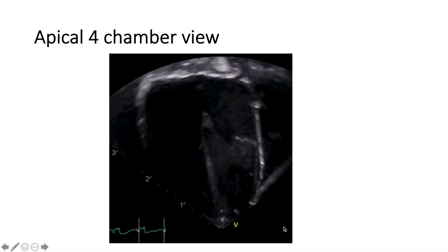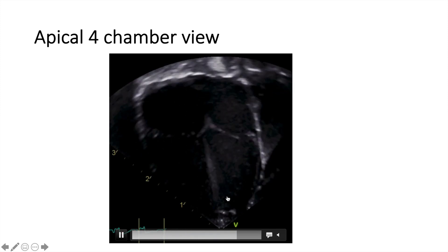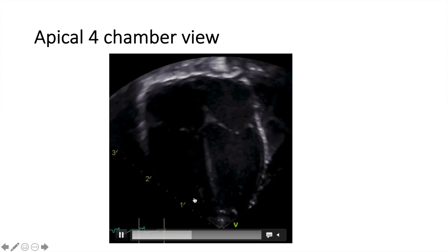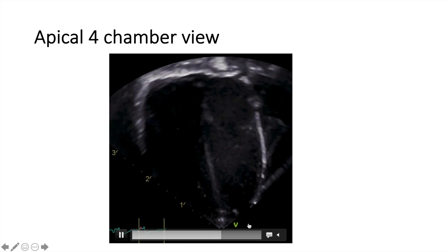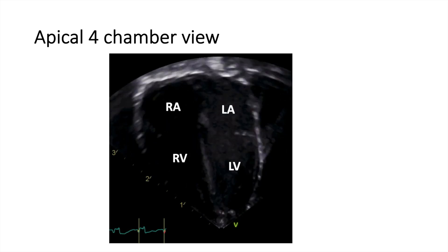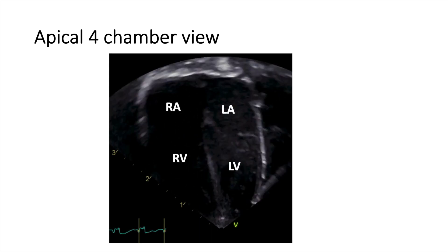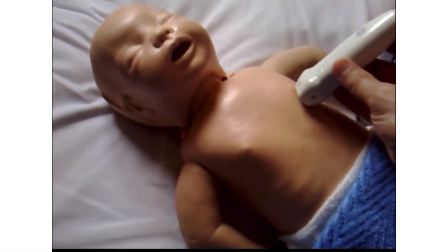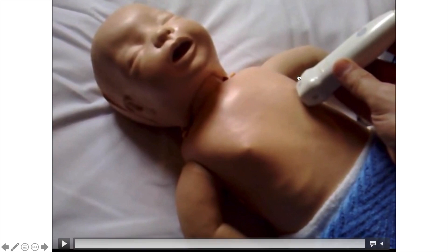You can see the apex at the bottom here, and as you know, we flipped the image as opposed to adult echocardiography — it's just easier for us to look at. It's pretty much the same principle. So it's called the four-chamber view; you can see the four chambers: the RA, LA, RV, and LV. To get it, we bring the probe and put it where we think the apex is, which is usually below the left nipple, and the marker of the probe should be towards the left shoulder. This is how we cut the heart into the four chambers.